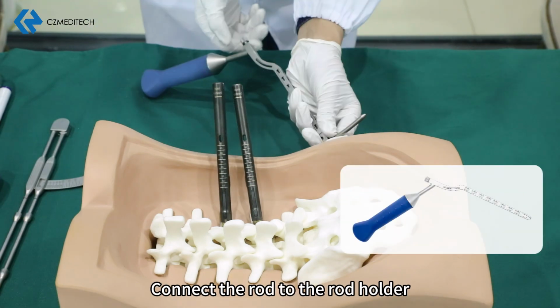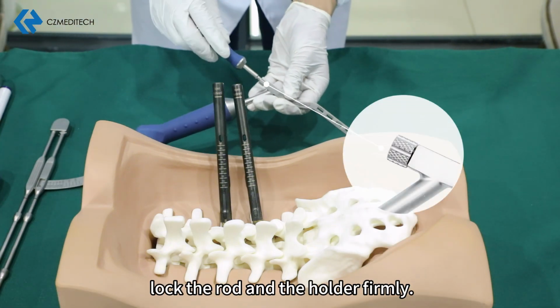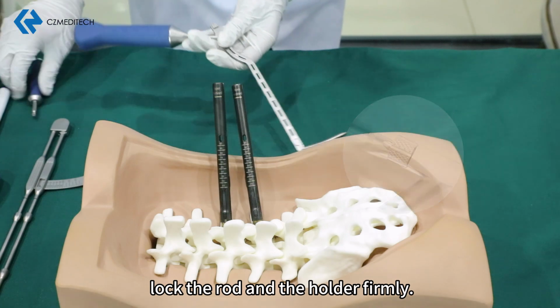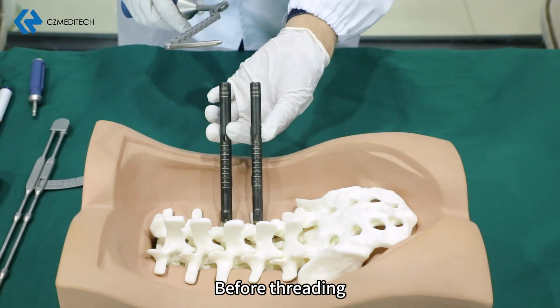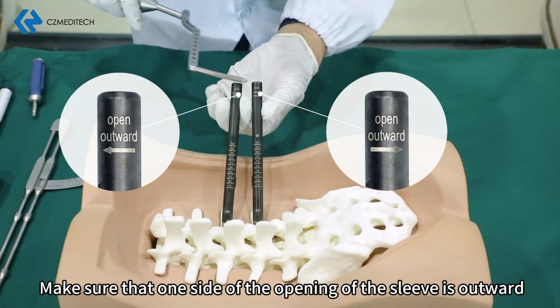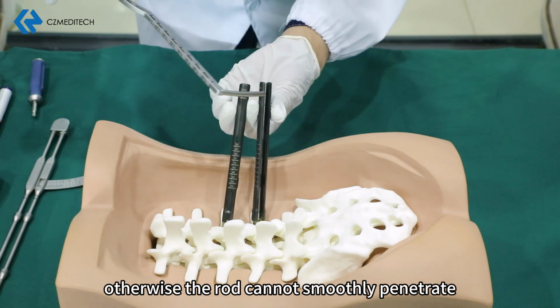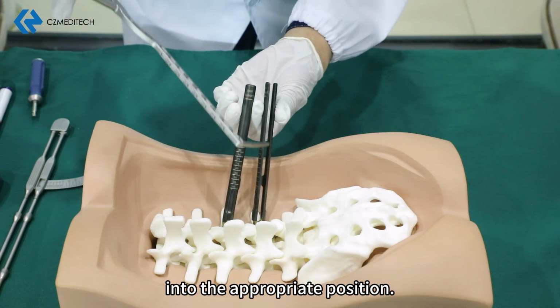Connect the rod to the rod holder. With a plum blossom screwdriver, lock the rod and the holder firmly. Before threading, confirm that the extension sleeve is at the correct angle. Make sure that one side of the opening of the sleeve is outward. Otherwise, the rod cannot smoothly penetrate into the appropriate position.